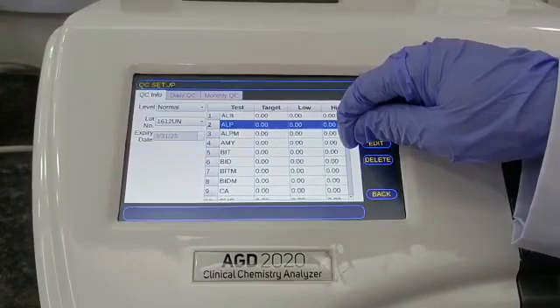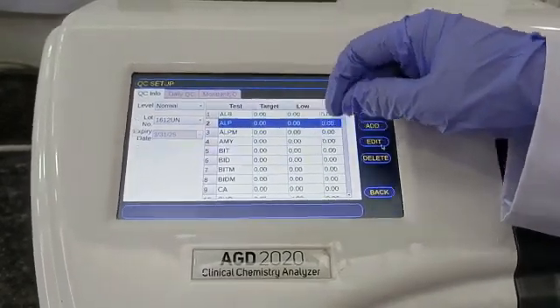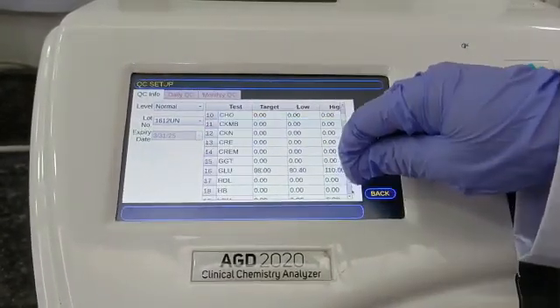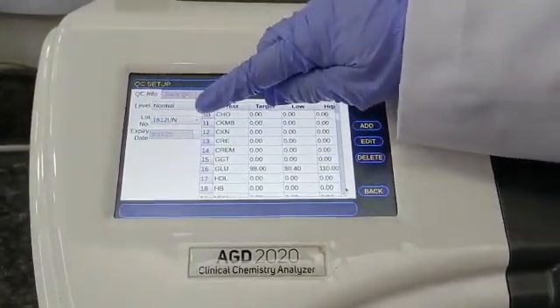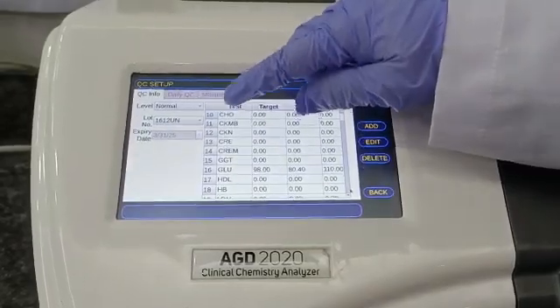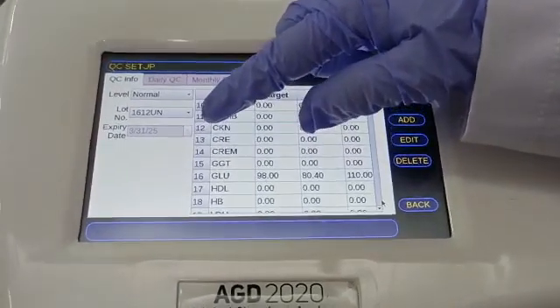The normal level lot number is 1612UN, and it has an expiry of 31st March 2025.